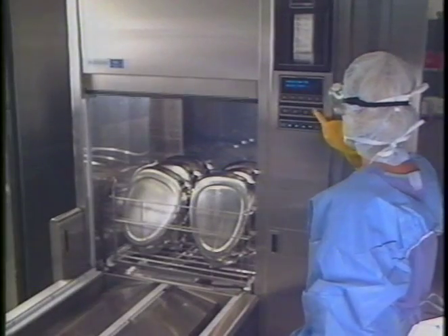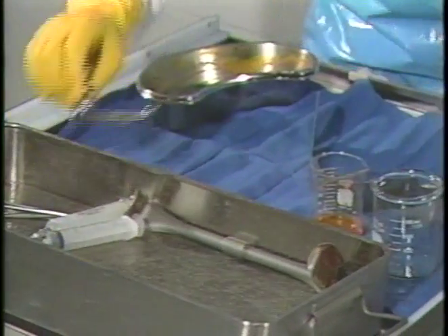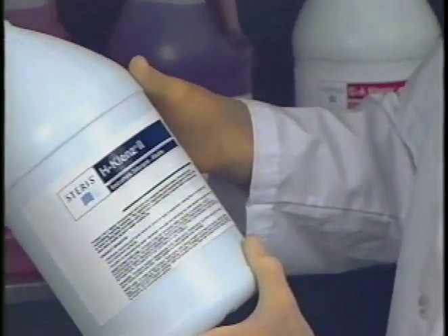In summary, this presentation today has given you an opportunity to review appropriate and safe work practices for your facility to enhance your productivity during the washing process. Proper cleaning is the first step in the decontamination process. Knowledge of the principles and techniques associated with the washing process can enhance your current quality assurance standards. How clean is clean? Currently, tests are available to you through the manufacturers of products and equipment to help you answer this question and any others you might have. Use them as a resource.